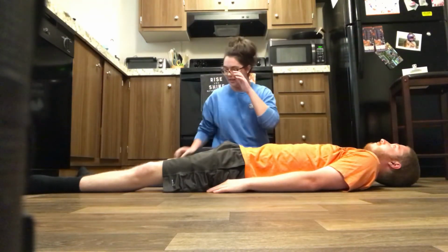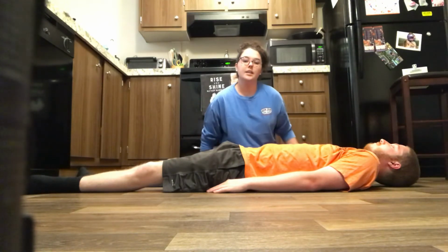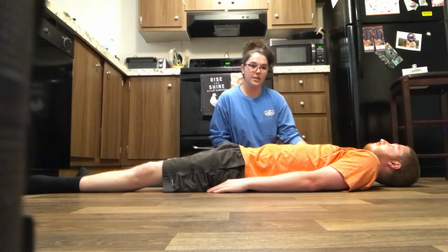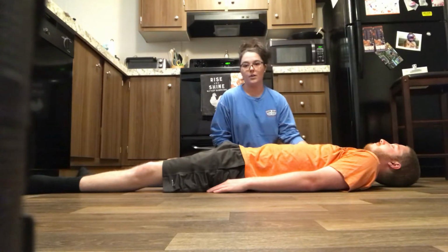We will be assessing the cardiovascular system. The first thing that we're going to do is listen to the patient's heart sounds. It is very important to inform the patient that you will be listening to their heart sounds and that nothing is wrong. It may take a few minutes to listen, but it's just so that I can listen thoroughly and make sure nothing is wrong.